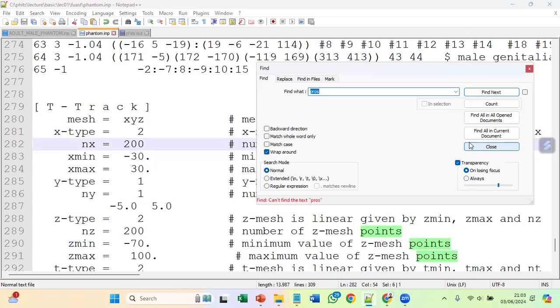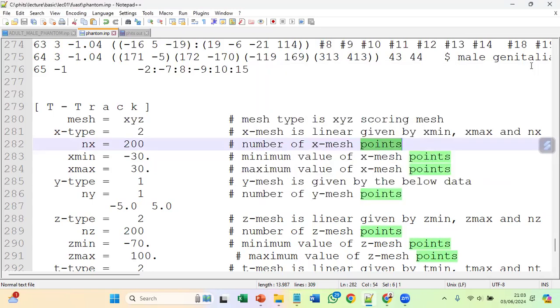So I have to model the prostate itself. It's not that difficult actually. I only need to model one organ. But if it's too much, I think I better pick another title of another type of cancer. Does that answer your question?